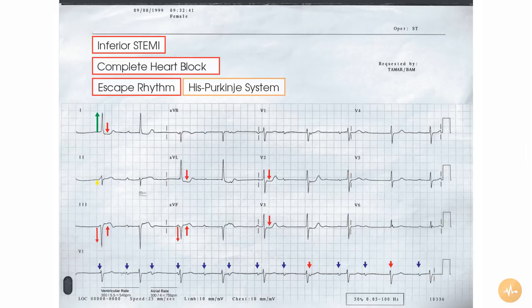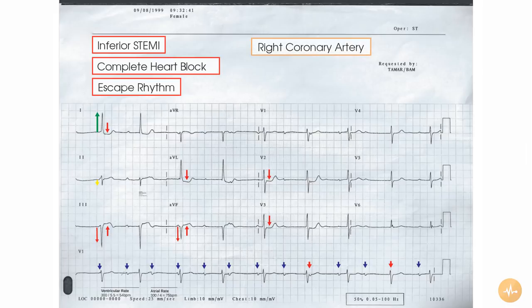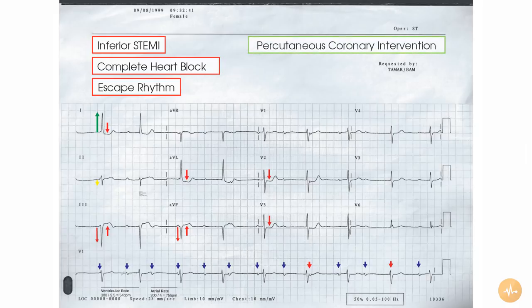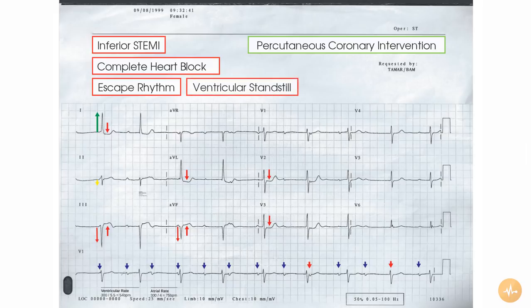The pathology is probably arising from the right coronary artery, as this supplies the inferior aspect of the heart and the sinoatrial node in the majority of patients. The patient should be treated with emergency PCI. The rhythm should continue to be monitored, as if the escape rhythm failed, the patient would be in ventricular standstill. A significant proportion of these patients require temporary pacing.